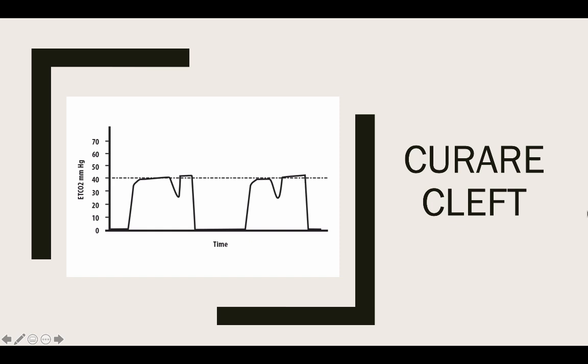We've got them on a ventilator, but they're doing this, right? If they're on a ventilator, why should they be inspiring in the middle of an expiration? Our ventilator is in complete control. Why should they be taking a breath in the middle of an expiration?